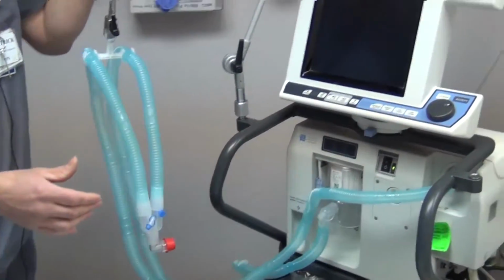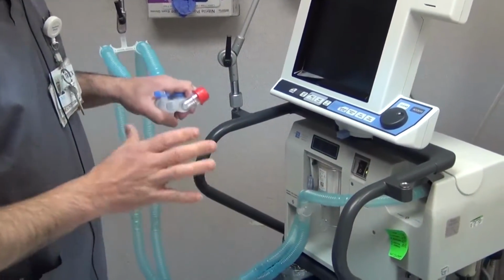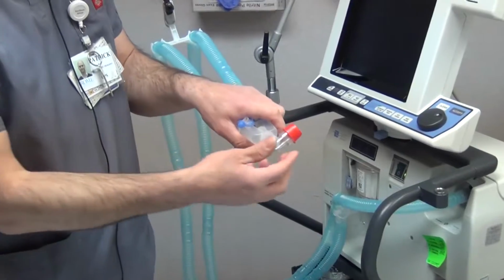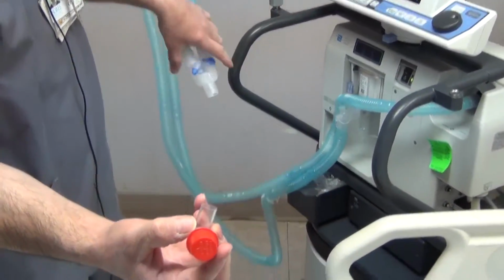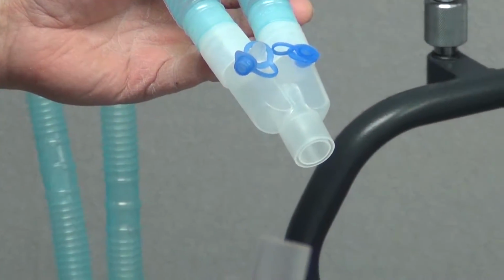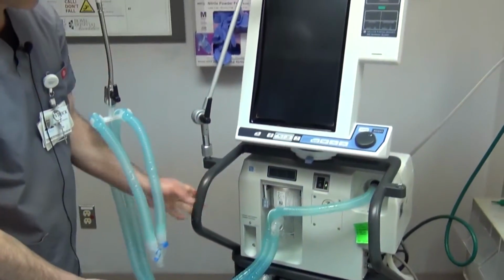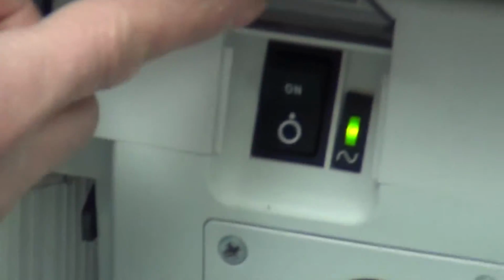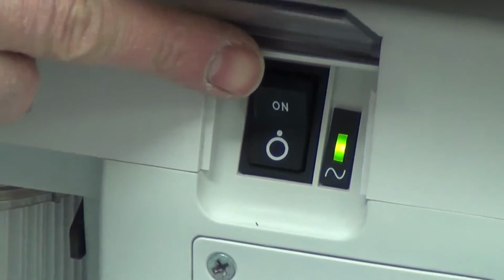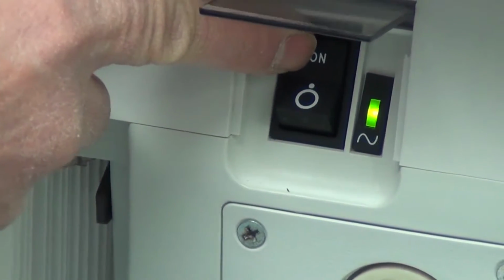All right. Now that you have the ventilator all connected, you want to make sure that you do not turn it on till you unplug this cap. This comes with the circuit. Even if the ventilator circuit is already on the ventilator, you want to take this off before you turn the ventilator on. If we look at the front of the ventilator, the on-off switch is right here. You'll lift this little plexiglass window and make sure it's unplugged again and turn the ventilator on.